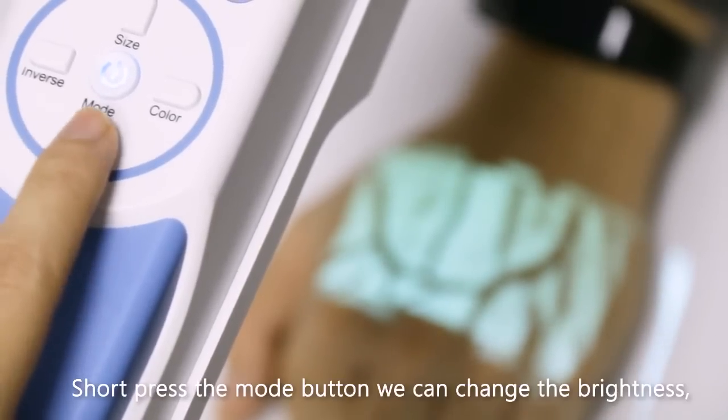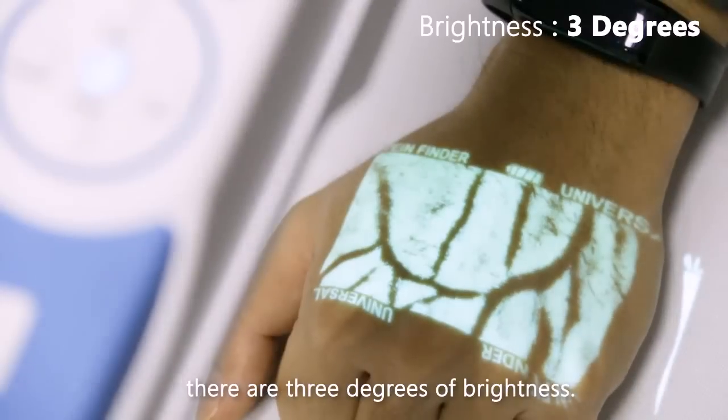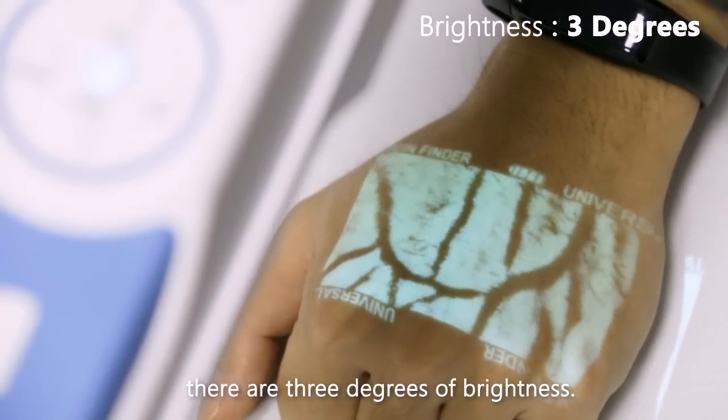Short press the mode button to change the brightness. There are three degrees of brightness.